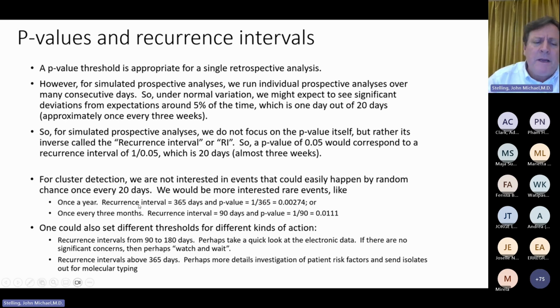But if this is my hospital, I might want a lower threshold, like 90 days. If I see an event like once every 3 months, yes, that could be random variation, and there's no need for me to take any action. On the other hand, it might be a small cluster. It might be the beginning of a cluster. So I don't necessarily say I will respond, but it's just a nice notification. You have something going on here.